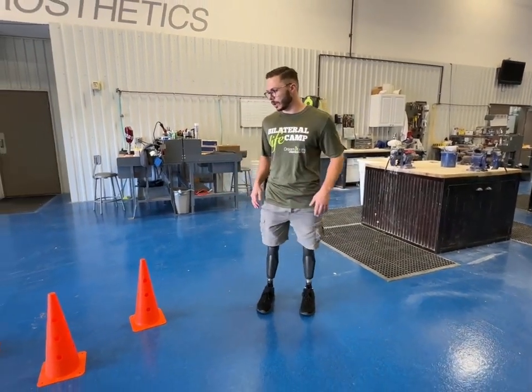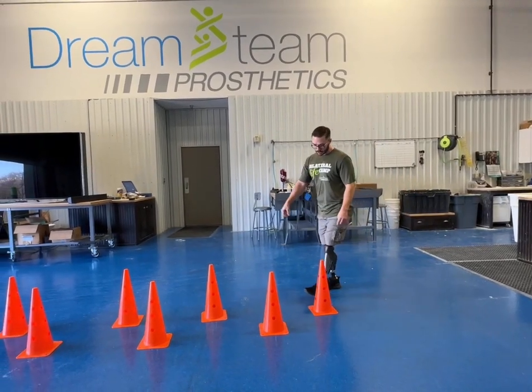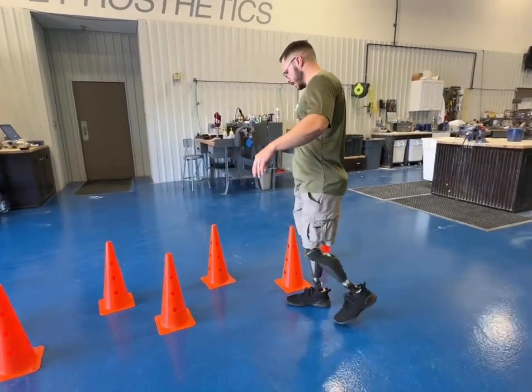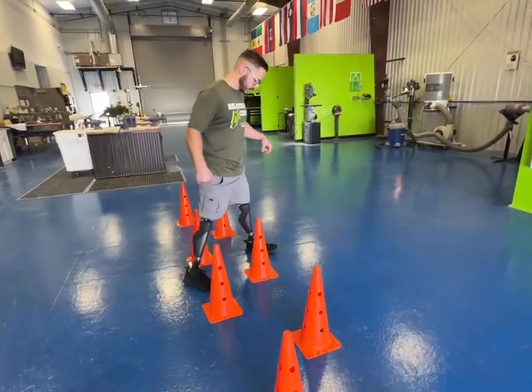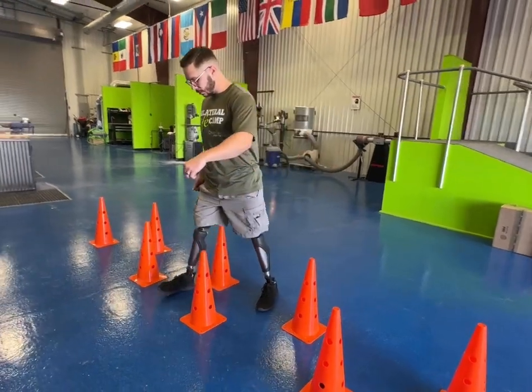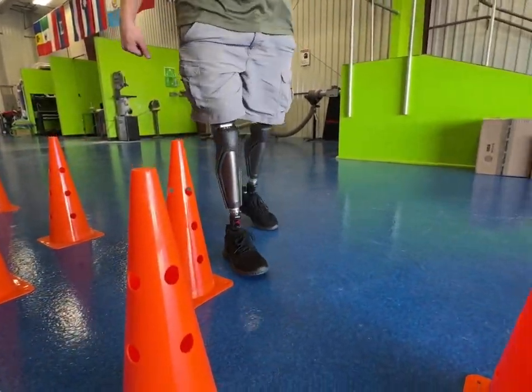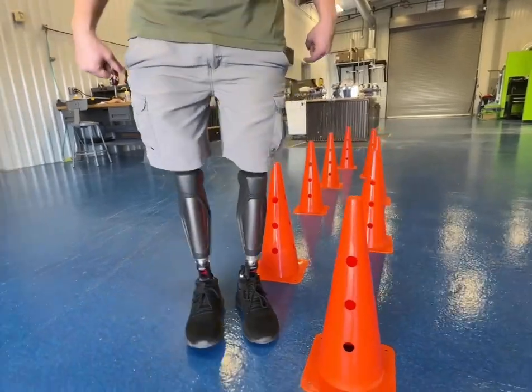If you have items around your home, you can practice this. Just weaving in and out of obstacles — this is how you push yourself to get a little bit better, or a lot better depending on how hard you work. Weaving in and out, trying my best not to touch anything.